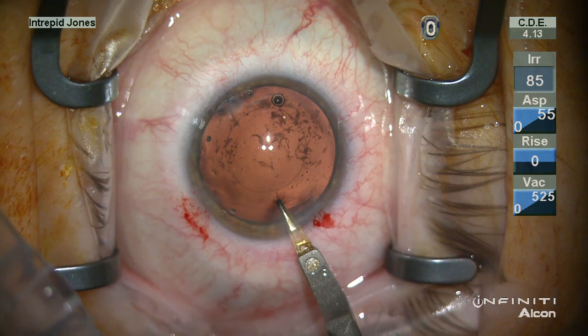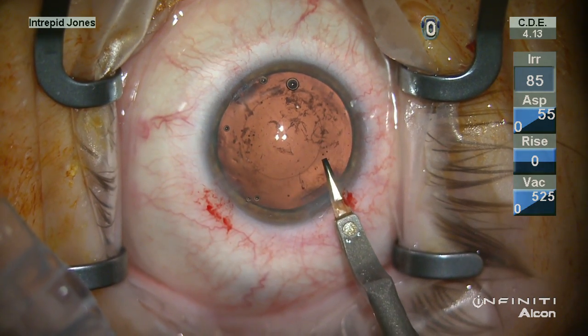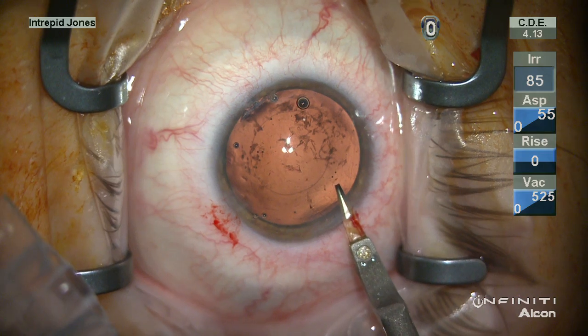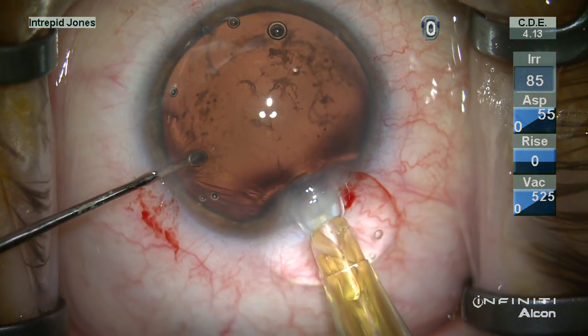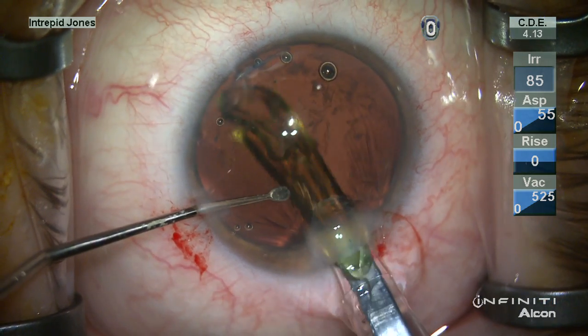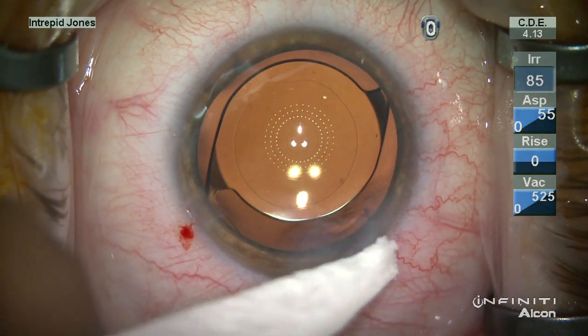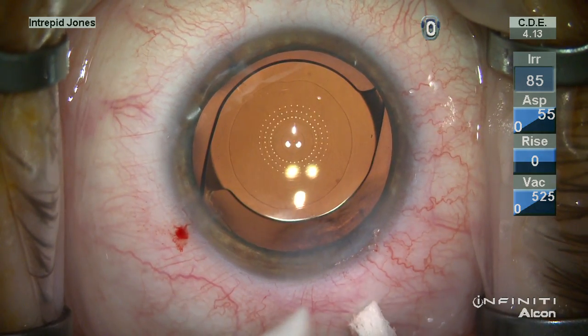In placing the IOL, I find it helpful to slightly enlarge this wound. I use a 2.2 millimeter internal wound and I find it's easier to enlarge this just slightly so there's less tension on the incision as the lens is placed — and they seal incredibly well. Thank you for your attention.